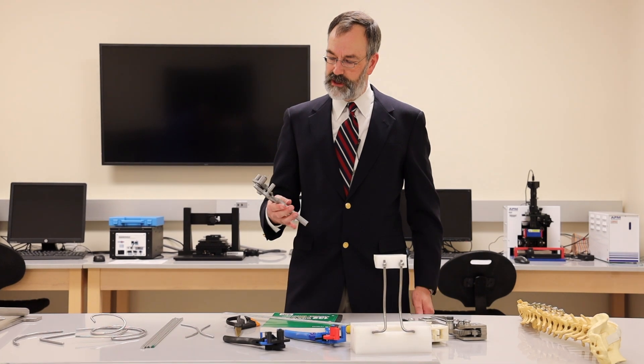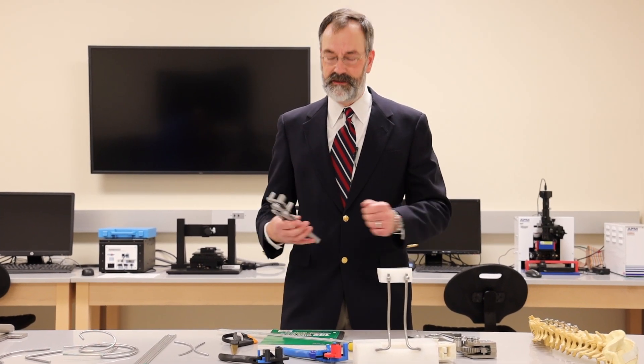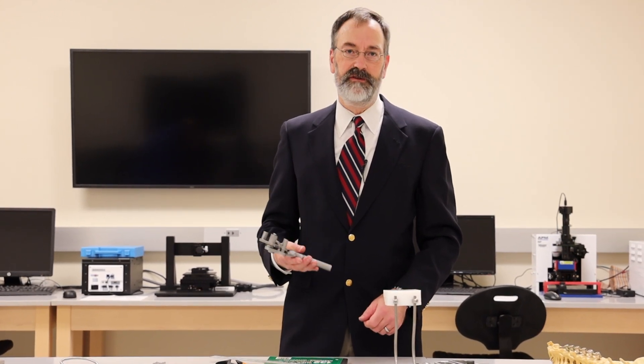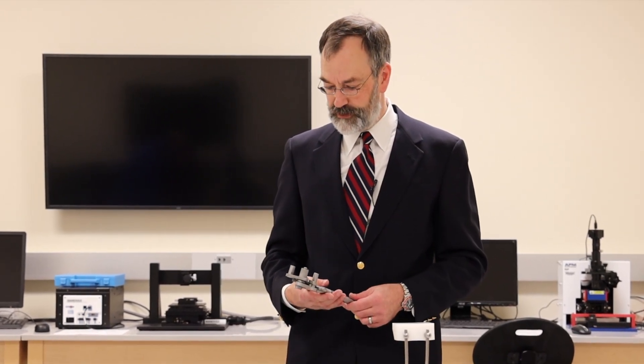The big advantage of using a rod bender like this is you do it right there at the patient — bend the rod, check, bend it, check — and save time during surgery, which means better outcomes for the patient, less risk for the patient.